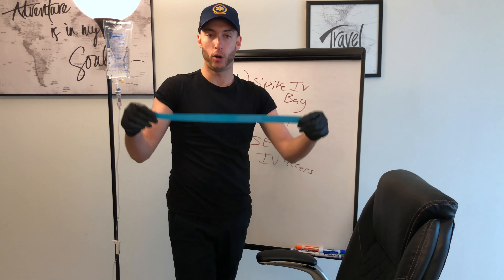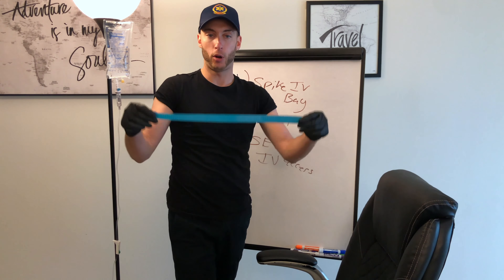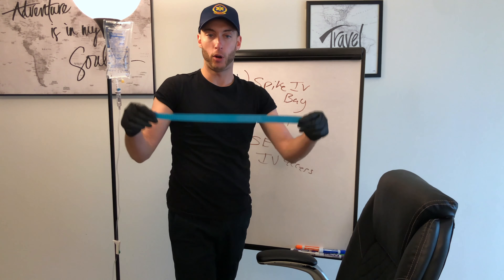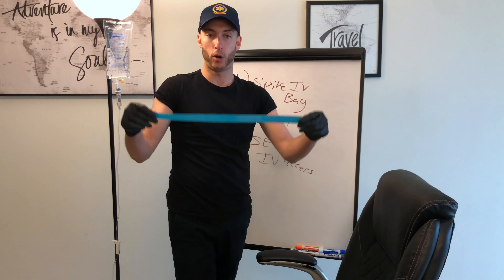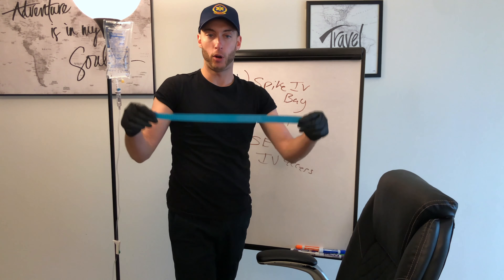Now we have to look for the patient's veins. The patient's arm is going to go down like this — I have it up so you can see better, so it's not going to be up. The next thing we've got to do is find the vein. You can see on me — I'm going to lower my arm and pump. You can see the veins right here. We've got a nice vein here, a nice vein here, and a vein here. We're looking for a straight vein. This vein would be a gem, this one would be a gem. I have a big nice vein here. See — I'm lowering and pumping. I don't even have a tourniquet; all I'm doing is lowering and pumping. If I had a tourniquet on, these would be really popped out. So right here is a great one. You can't really miss an IV on me. So now we're going to grab our alcohol prep and wipe the surface in a circular motion or away from the site.